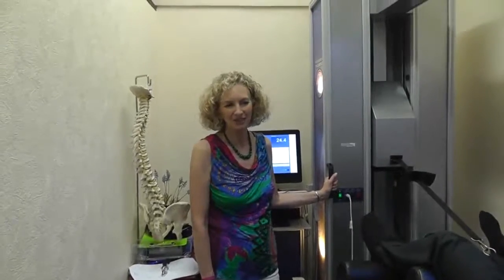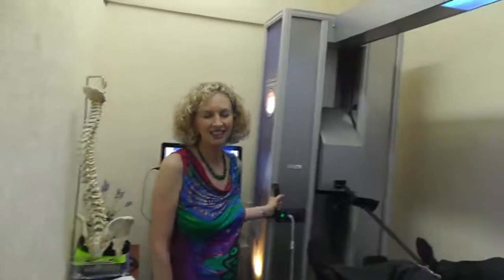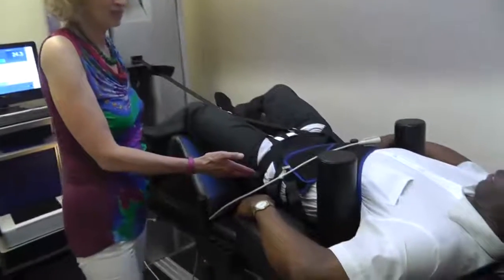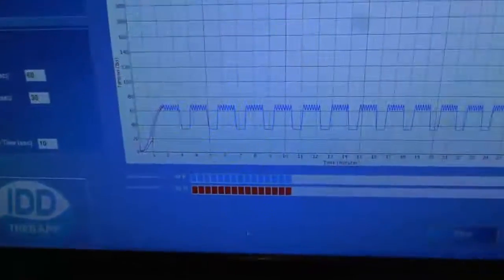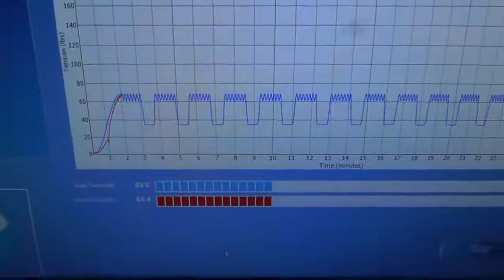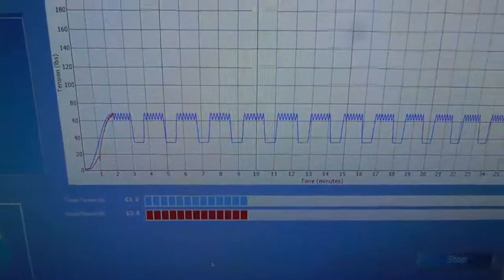Hi, so we're just giving John a treatment on the IDD therapy machine and he's having some lumbar treatment. He's got a harness on his pelvis and another one on his upper body and we're pulling just below half body weight. If you can see on the screen now, the trace is coming up to about 68 pounds — that's the red line coming up to track now.